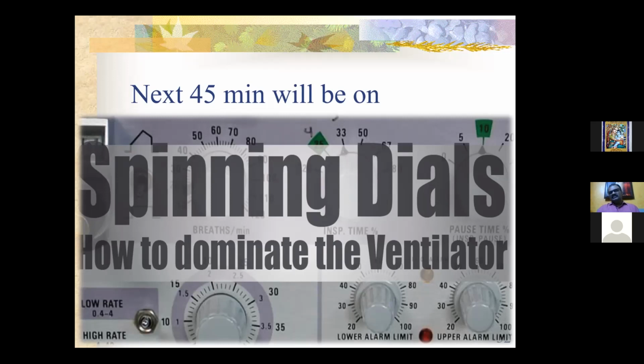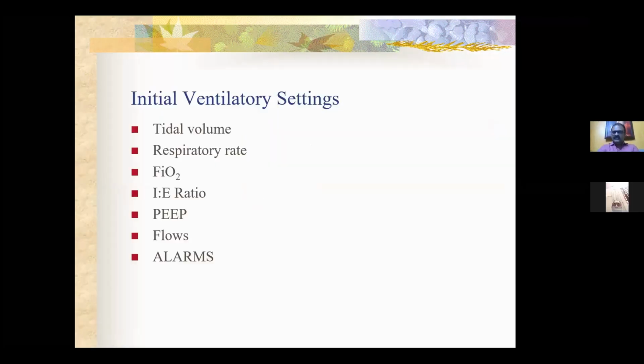First, we'll select the mode. We have already discussed the modes. Usually what we use are the ACMV modes. So it can be a pressure or a volume control mode. You can select any of the two. There are certain advantages for each. That's basically for disease-specific ventilation or something like that. So let us take that we are selecting an ACMV mode.